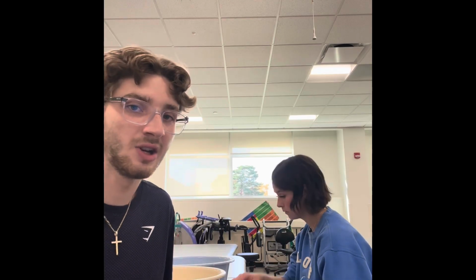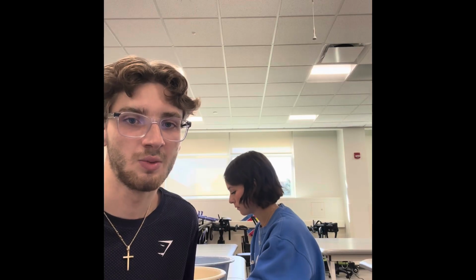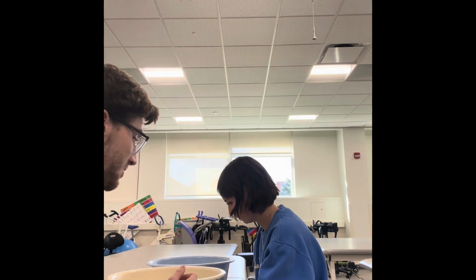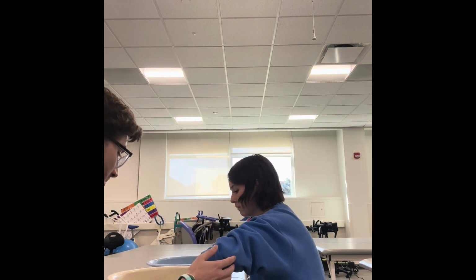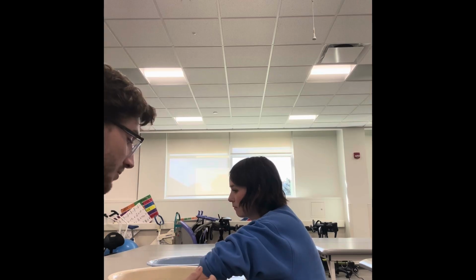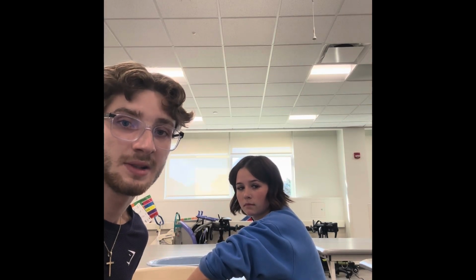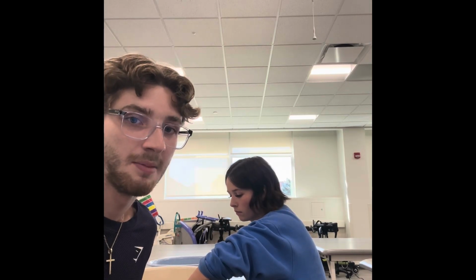So to provide a small demonstration of that, I'm going to ask the patient with some peripheral acute edema or a peripheral acute swelling in her left hand to place her left hand into the warm contrast bath. And she's gonna sit in that position for 4 to 5 minutes. And then we'll say that time has passed just for time purposes.